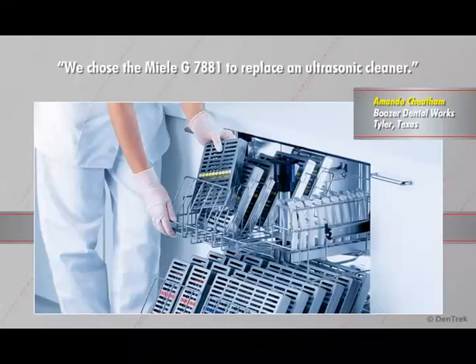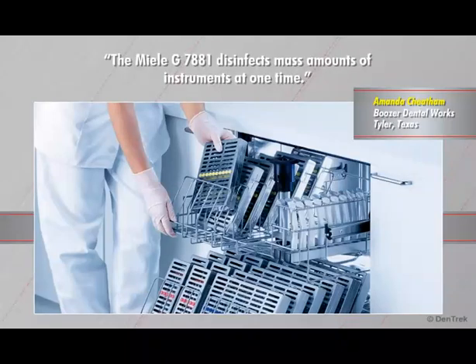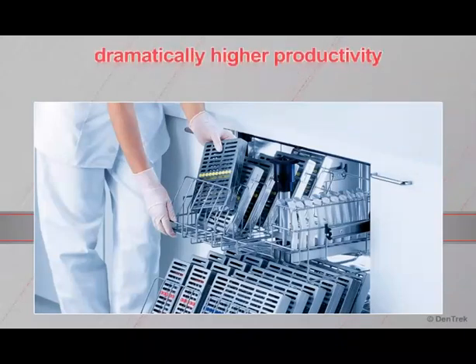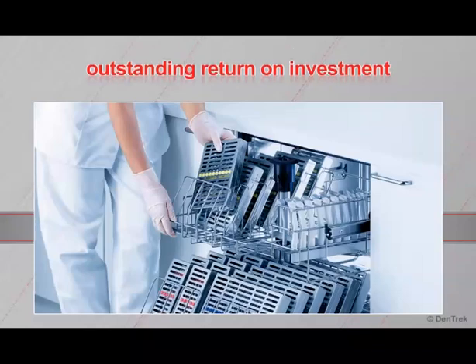We chose the Miele G7881 to replace an ultrasonic cleaner. The Miele G7881 disinfects mass amounts of instruments at one time. With more time chairside, we have increased our productivity by 50%. With dramatically higher productivity and improved workflow, the Miele G7881 offers an outstanding return on investment.